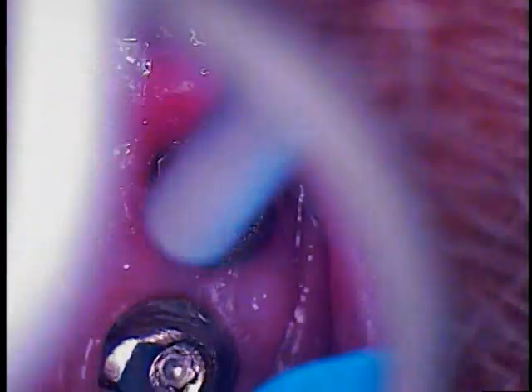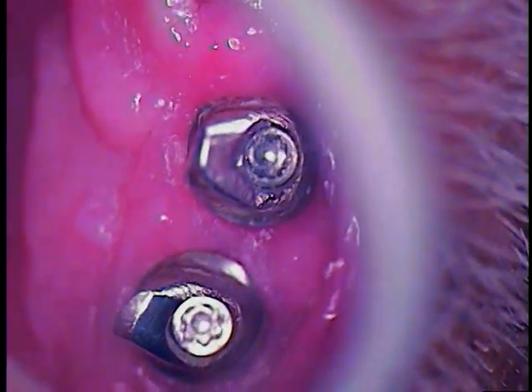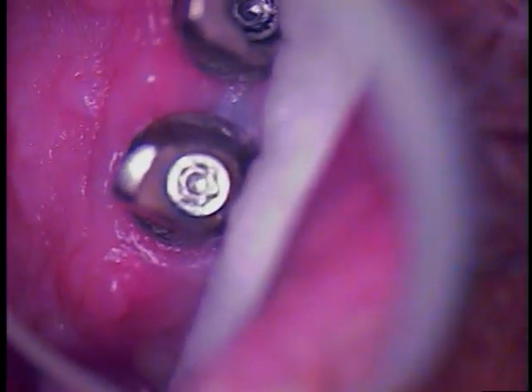Now if we compare five and six together, you're going to be able to see the configuration of the screw. We've already cleaned out the bio-burden and any food particles. A pristine star screw — what we call the basal screw of a Strauman case — has a definite configuration that you can see.